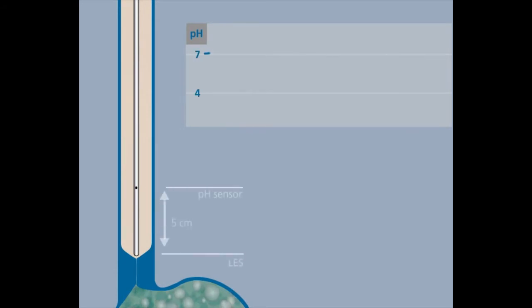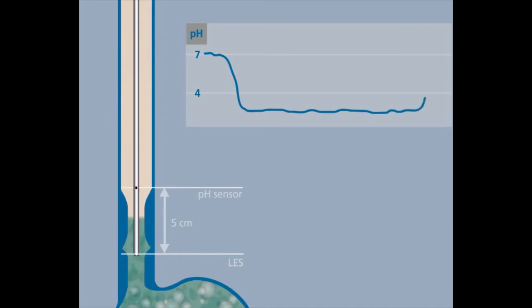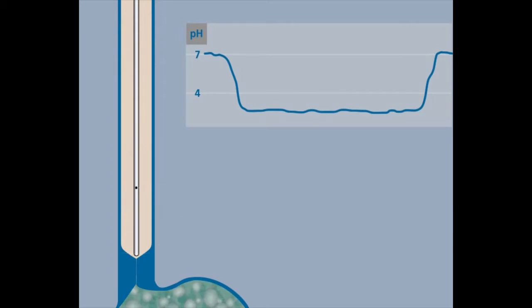Until recently, reflux was detected by measuring the pH in the esophagus. When acidic material enters the esophagus, the pH drops. With pH monitoring, the proximal extent of gastric content cannot be detected. pH studies can only detect acidic reflux episodes. Under acid secretion inhibiting medication, most of the reflux episodes are weakly acidic. However, these reflux episodes can also cause symptoms and cannot be detected in pH studies.